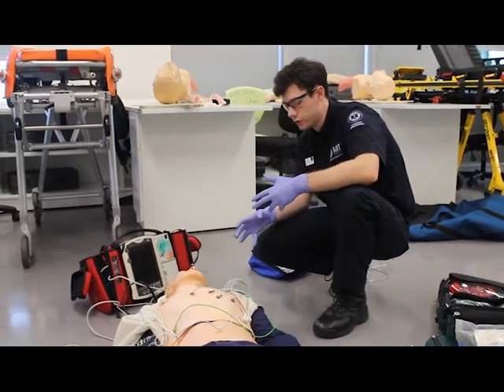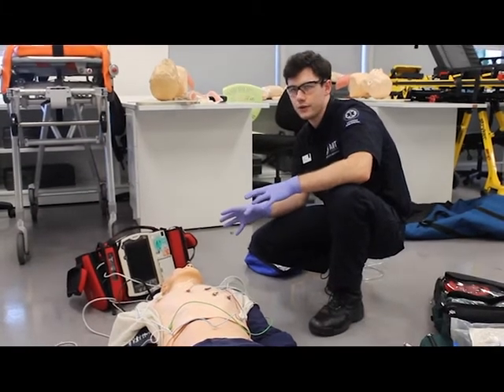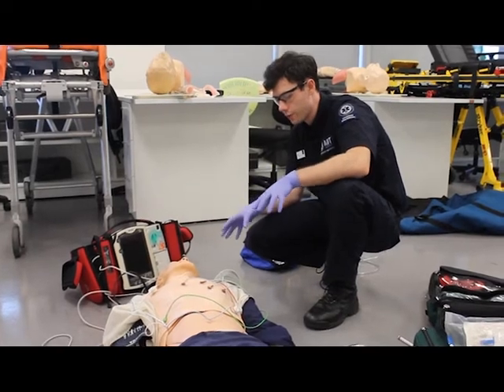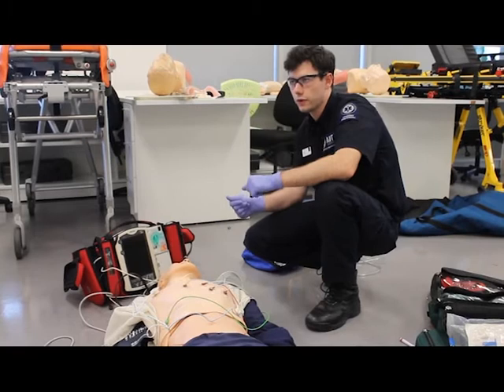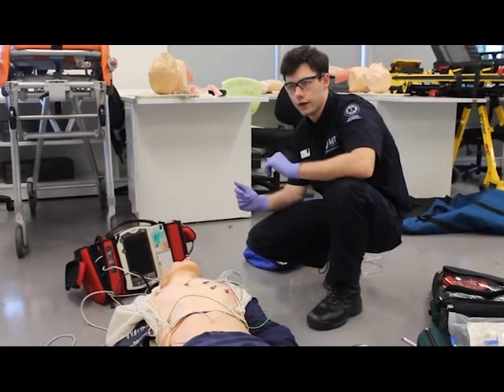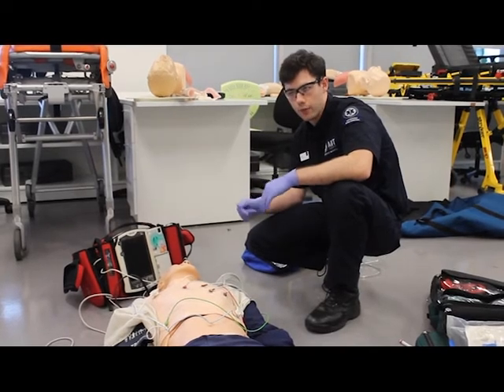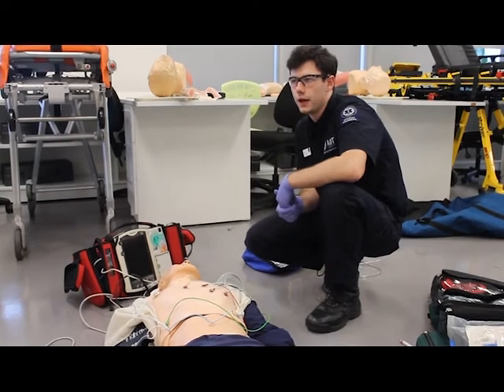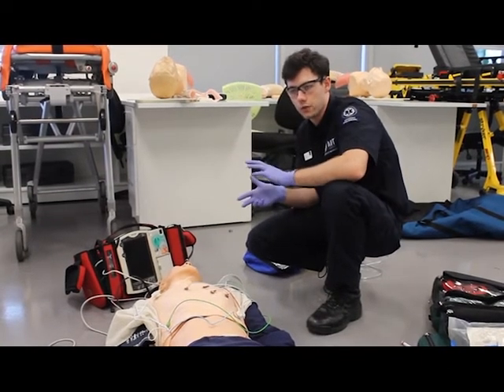Before we dive headfirst into our cardioversion, what I think we want to do is just have a quick think about some differential diagnosis. We've taken our 12 lead just to see if we've got any signs of SVT with aberrancy, but it doesn't look like that from the history we've taken. No sign of electrolyte imbalance, no history of SVT or Wolff-Parkinson-White.